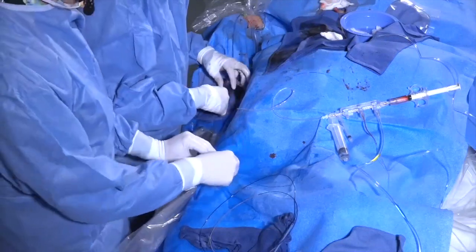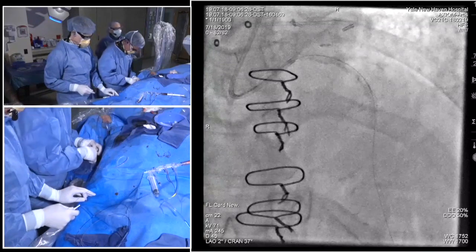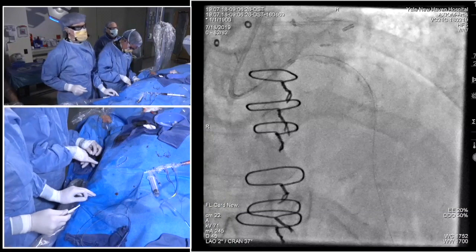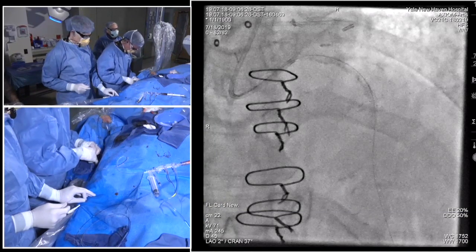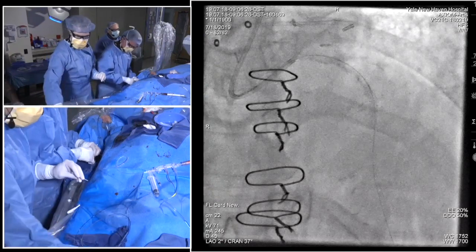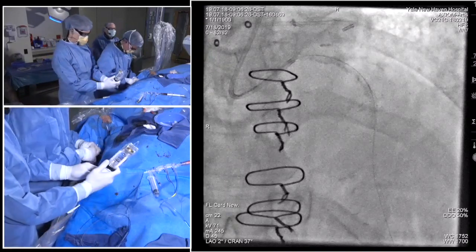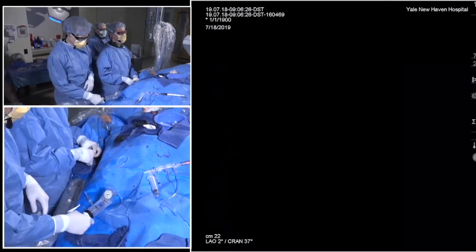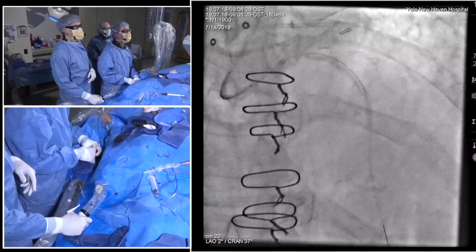That's one of the reasons, as you know, there's an ongoing randomized trial with the CSI atherectomy device versus conventional balloon angioplasty or specialty balloons to try to show this, because those of us who have done this for a long time know exactly what you're talking about, where you don't do it and we hit roto-regret. But I think it's important to try to prove it, so hopefully we'll be able to contribute to the scientific evidence base by doing a trial like that, which would then give people more reason to understand how to do these things.